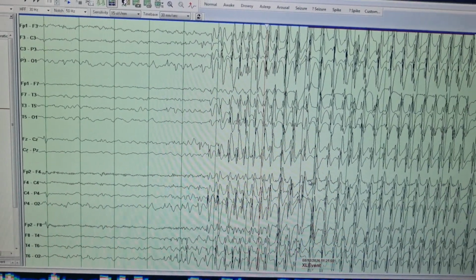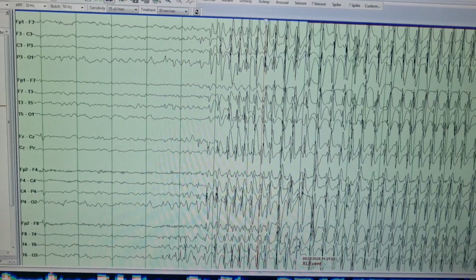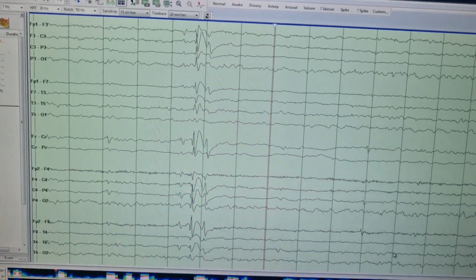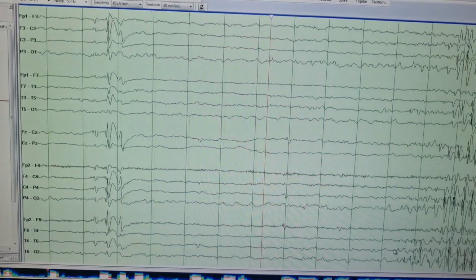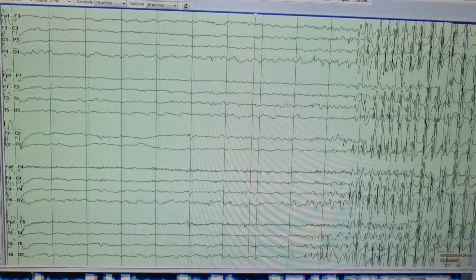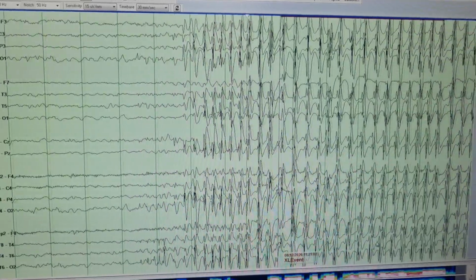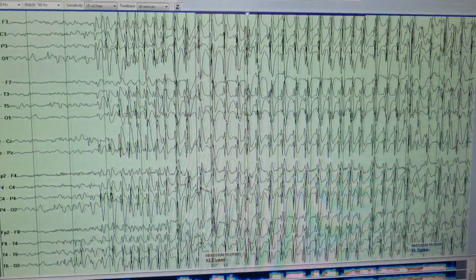There is another condition which we call electrographic seizure, in which only the electric activity is abnormal. So I will mention the criteria of that. And status epilepticus can be convulsive or non-convulsive. In convulsive, you have the physical abnormalities in the child. That child can have myoclonic seizure, clonic seizure, or tonic-clonic seizures.